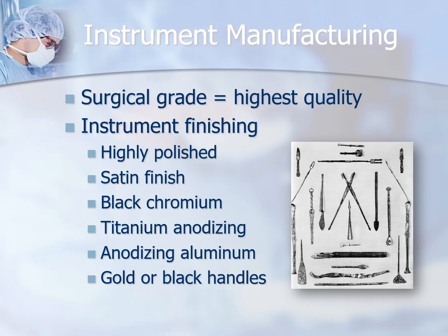And when we got back to the decontamination area, it was so frustrating to have to separate out these 3 different types of instruments. Which ones were the really bad ones that needed to go in the trash? Which ones were the floor grade ones so that we could set them aside and package them differently to return them to the floor? And which ones had they come down to the sterile storage area and pulled out some instruments there to use on the floor instead?